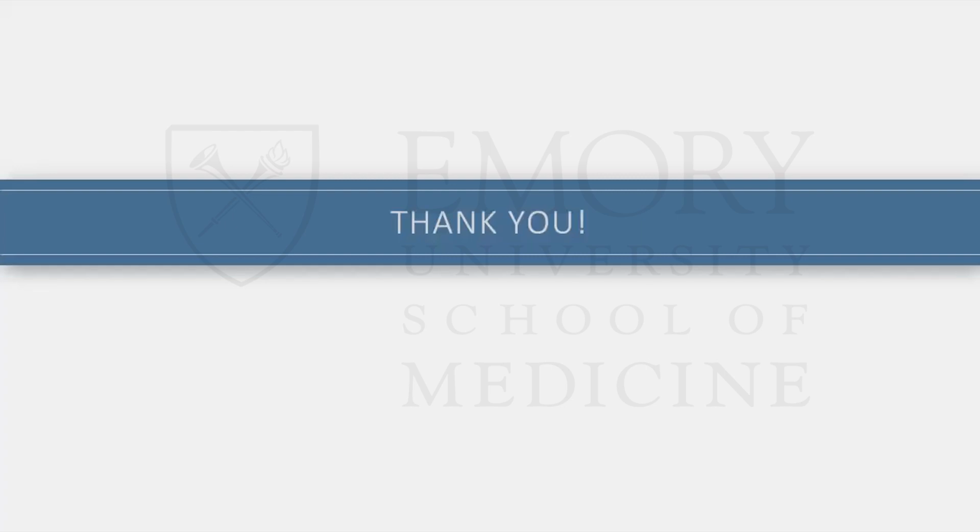You're also looking at things like the patient's age and LV wall thickness, and taking into account the image quality and all these nuanced things, which is very difficult to get a grasp on until you have time and experience reading a lot of echoes. I'm still frequently flummoxed trying to figure out someone's diastolic function. So it's incredibly difficult and complicated.